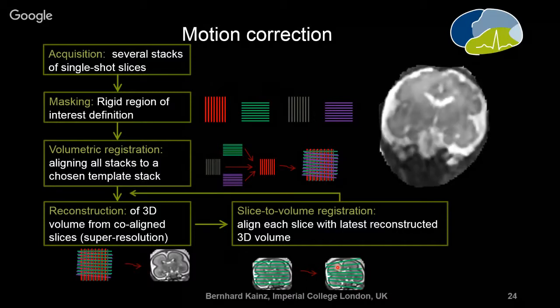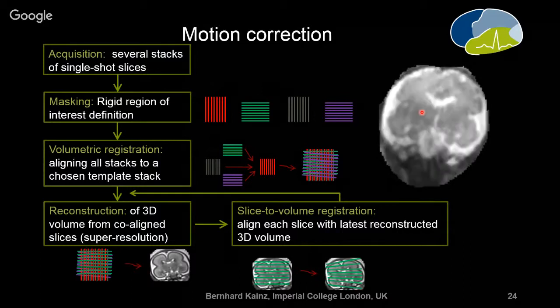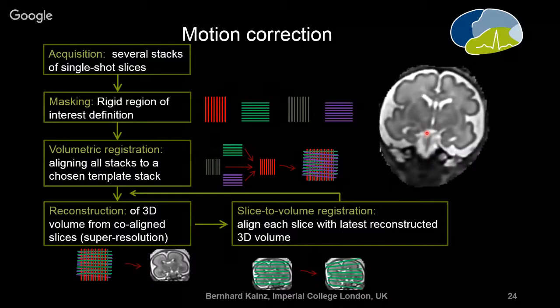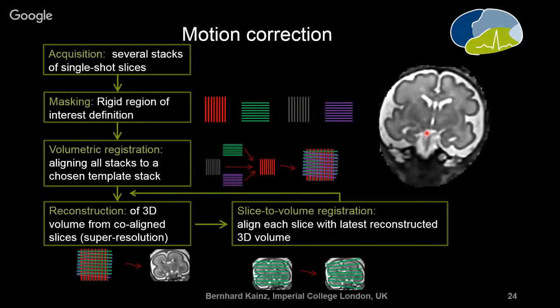What you can do next is just to go back and reconstruct again using a measured point spread function, and then to get a model which is a little bit better. If you look at this, there is the very first stage, a very blurry, ugly version of that, and then after a few iterations, it starts to improve and fit quite well the actually measured data. The final scene probably never happened like this, right? This is just the optimum of how all the acquired slices in orthogonal directions fit best to each other. The structure will have looked like this, but the fetus might never have gazed in this specific direction.